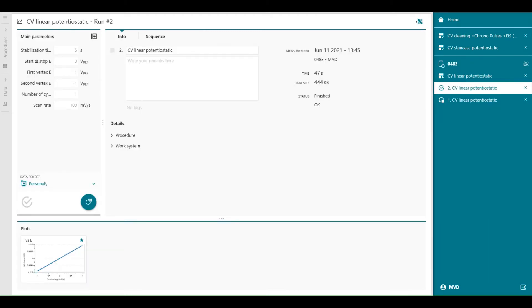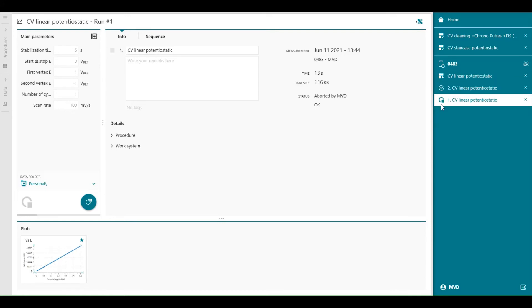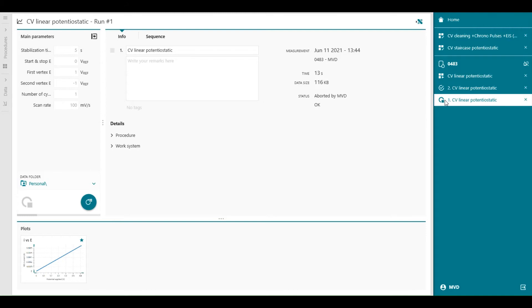Below the procedure, we have runs that were collected on the work system during our session. Another run is aborted during measurement, and this you will find with the stop icon in the tile. The session starts when a work system is claimed, and it ends when it is released. The runs during the present session are assigned a run number, which continues in ascending order as more runs are collected.